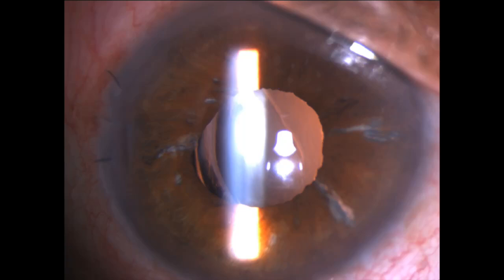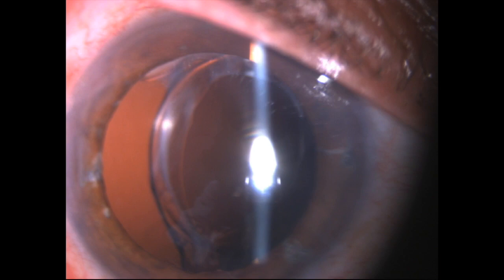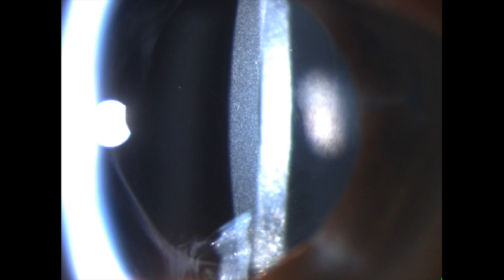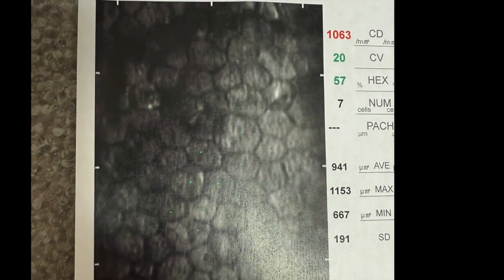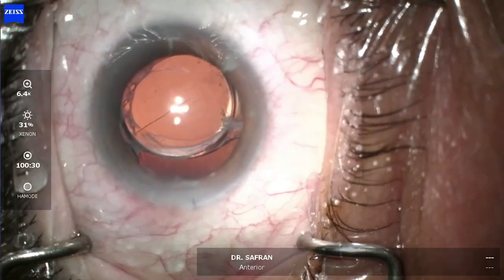This is a businessman from India who had cataract surgery six months earlier with a Raynor EMV lens placed. He complains of severe glare and blurred vision. The pupil is a bit atonic and dilated beyond the edge of the lens, which has descended within the bag about one millimeter toward the nasal side. The lens itself is showing some hazy changes to its material, and the endothelial cell count is on the low side, around 1,000.